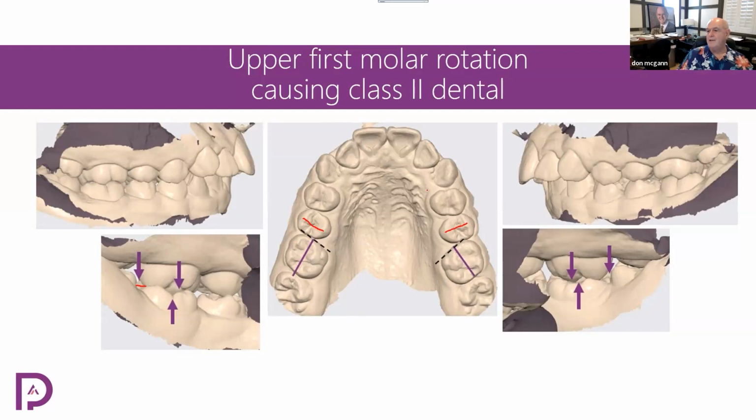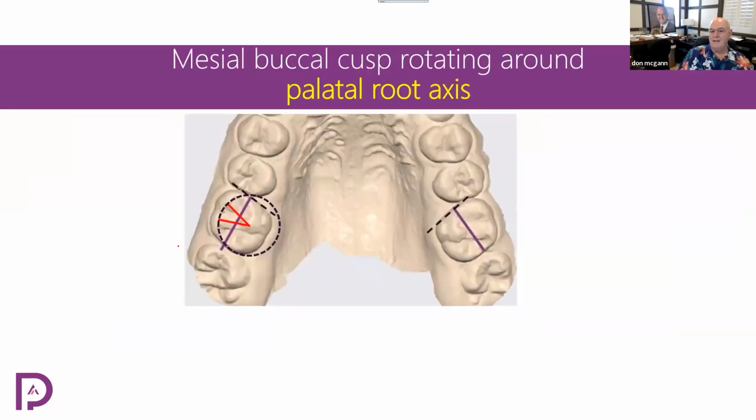So usually in this aligner thing, I would say distal rotation is, in our terminology, a mesial rotation, but you want to rotate the tooth distal. You have to think the opposite for the technician. A distal rotation of the upper molars and the upper second bicuspids, a distal rotation. And then you ask yourself, do I want to distalize even more with the 7 present? Okay? So let's look and see how much you might be able to get.